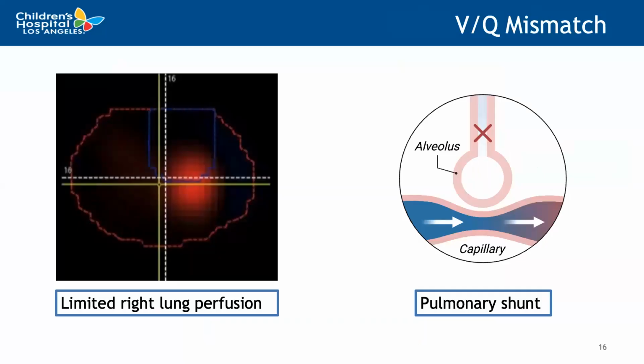So lucky for us, EIT does have an ability to see lung perfusion. We are able to do this via an offline analysis, which is called the pulsatility feature. This measures the amplitude of cyclic changes in the lung impedance caused by the passage of the cardiac stroke volume through the lung. And so the EIT belt itself actually has an EKG built in. Normally we would negate the cardiac signal to get the ventilation image, but we can actually use the opposite for the purposes of looking at pulsatility and perfusion.